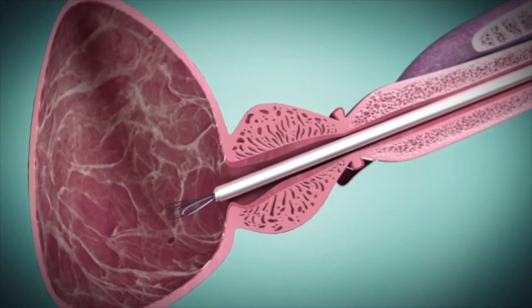It's had over 3 years of patient follow-up, and I'll talk to you about iTind as well as Urolift and Rezum. So let's start with iTind since it's the newest. iTind again was approved in 2020. It's a procedure that can be done in the office. It can also be done in the hospital or the surgery center. It takes about 20 minutes to do the procedure, and what it essentially does is it reshapes the prostate.